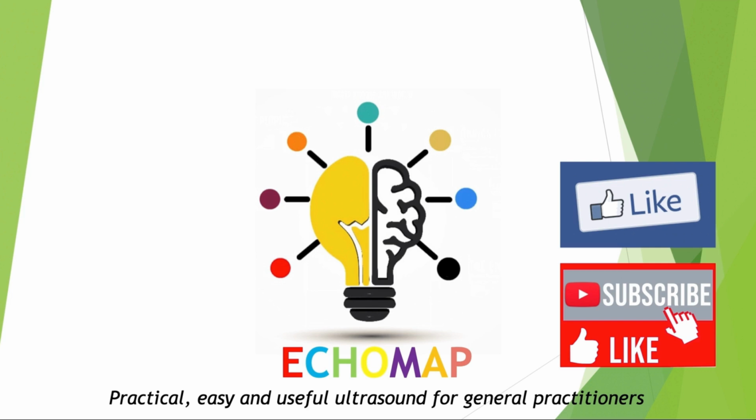Here's a classic gallbladder pitfall, but it's easy to avoid if you know its artifacts inside and out.